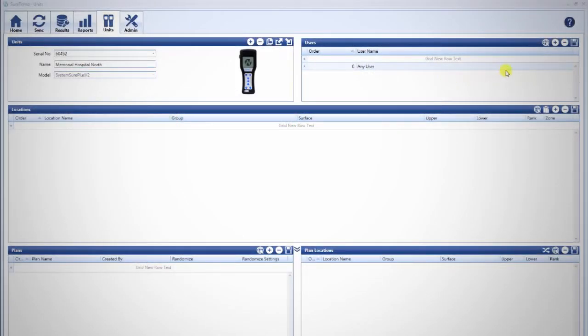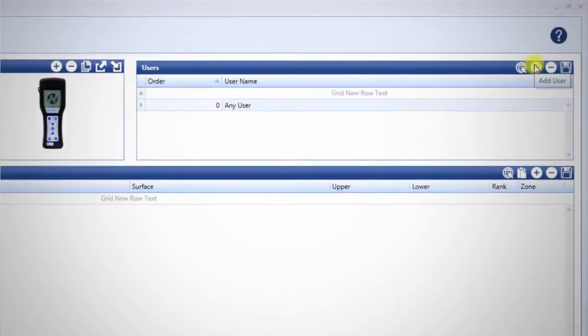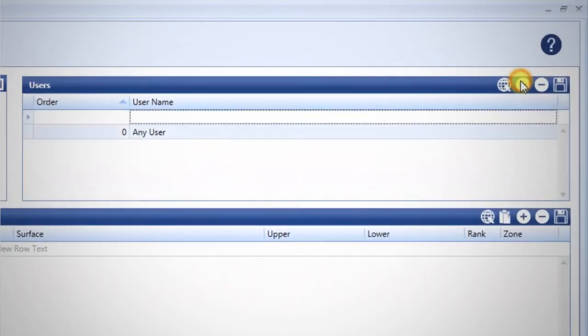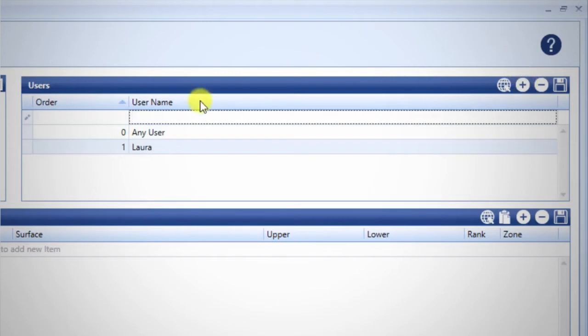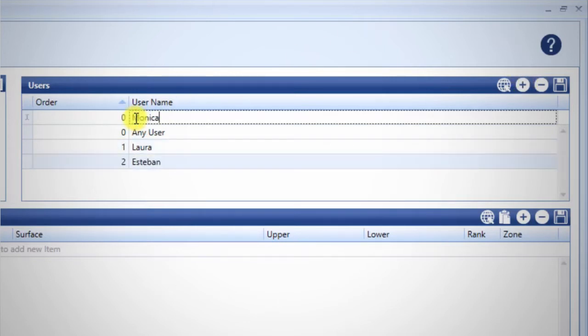On the Units tab, click the plus sign on the top right of the Users pane. The field under Username will be selected. Type the username and press Enter. You may also click into this box and start typing, then press Enter when finished.